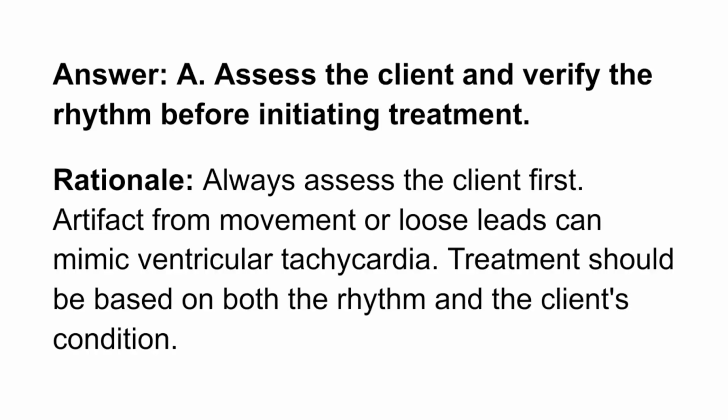Rationale: always assess the client first. Artifact from movement or loose leads can mimic ventricular tachycardia. Treatment should be based on both the rhythm and the client's condition.